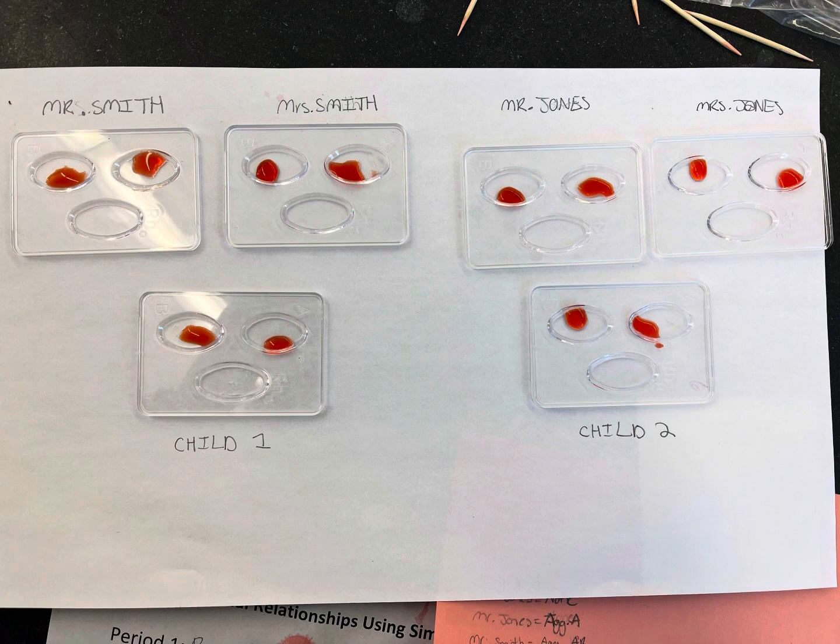For child 2, no agglutination occurred, meaning he had type O. This matched Mrs. Jones' blood type, meaning child 2 belonged to the Jones family.